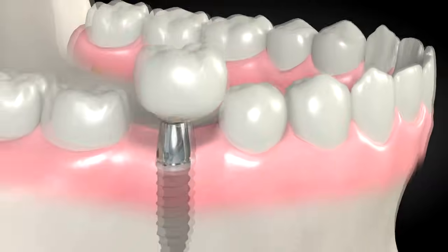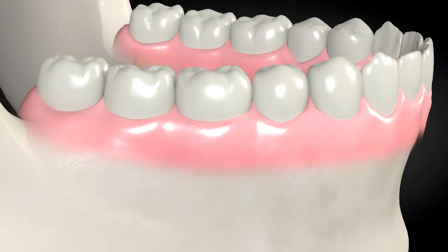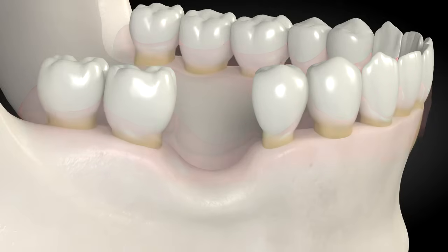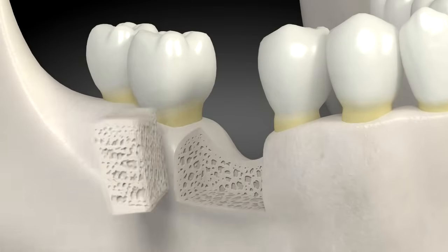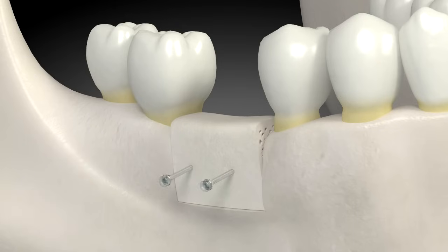A tooth is placed on the dental implant. For patients that have more bone missing, a technique involving placing blocks of bone in the area with missing bone works well. The blocks are shaped to the desired size and placed with titanium screws.